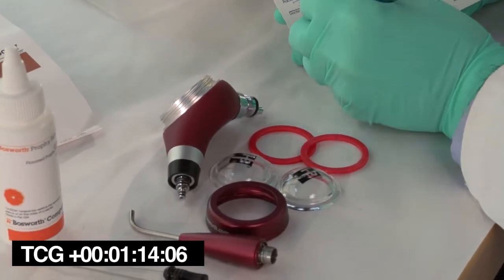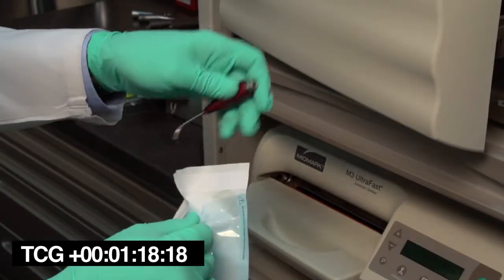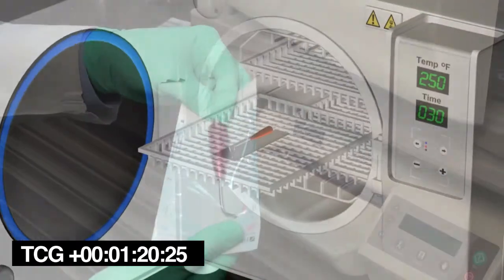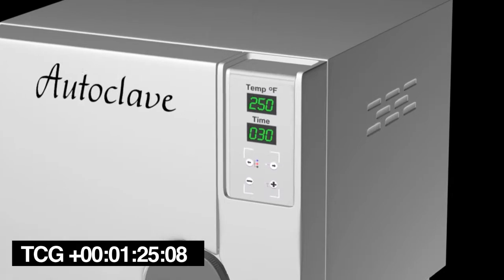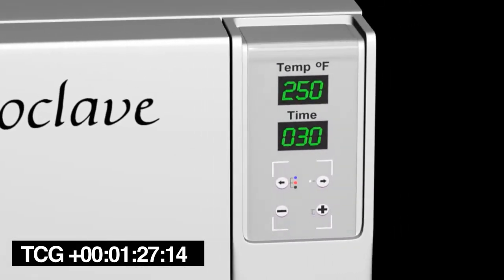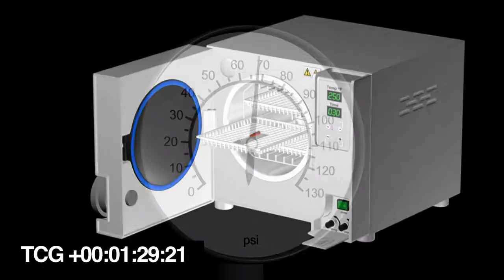Let's get your Bosworth air polisher ready to use. Sterilize the nozzle prior to first use by autoclaving at 121 degrees Celsius, 250 degrees Fahrenheit for 30 minutes and allow the nozzle to dry for 15 minutes.